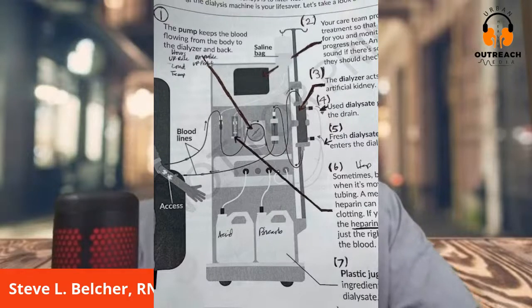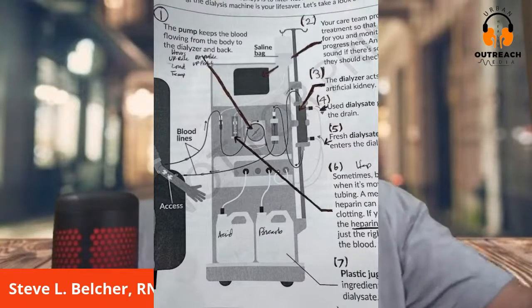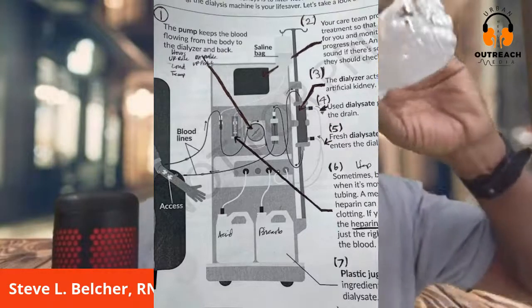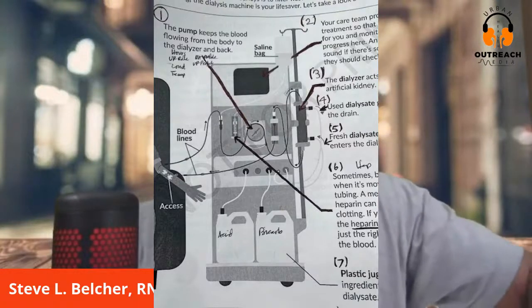So when that pump stops, anytime the machine alarms, the pump is going to stop. That's what it's designed to do. If that red light comes on and it's beeping, you better know that your blood has stopped moving. And when your blood has stopped moving, you're at high risk of clotting your system, especially if you're not getting any heparin or blood thinner. So number one is the blood pump.